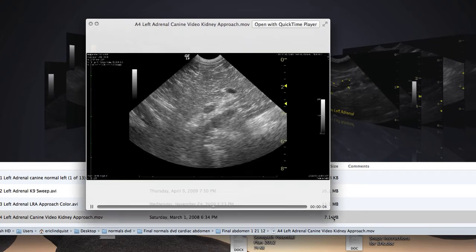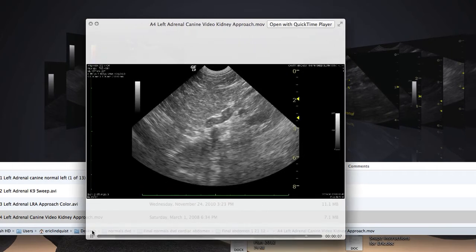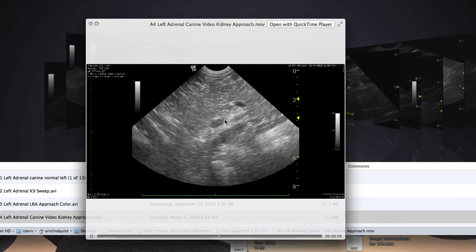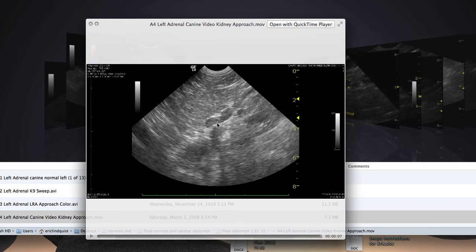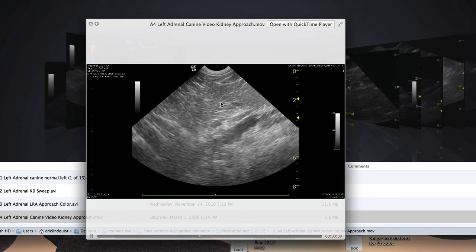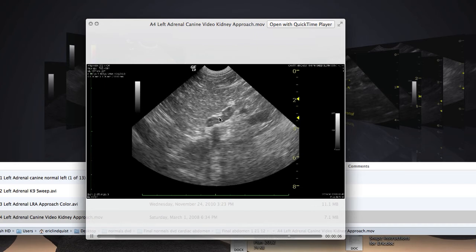The other approach is the more traditional one: go to the left kidney in a nice long axis and fan medially. The left renal artery comes into view and the left adrenal gland comes into view. Here you're scanning at more of a distance, so this is okay for a bigger dog. But if you can minimize the distance to one to two centimeters using the aorta as a template and run to that left renal artery, we're already looking at a one-centimeter-wide aorta. So picking up a 0.7 or 0.8 centimeter adrenal is a lot easier than coming from the six or seven centimeter left kidney and fanning medially to find the left adrenal gland.